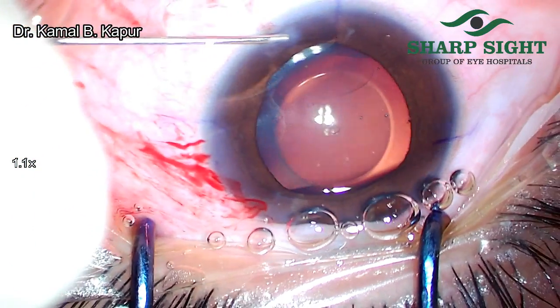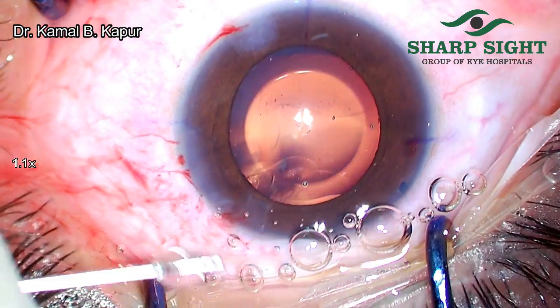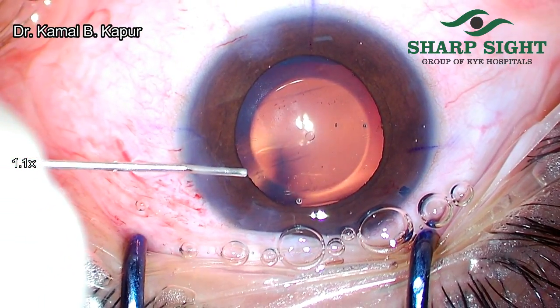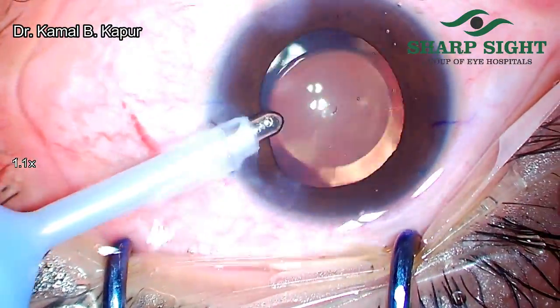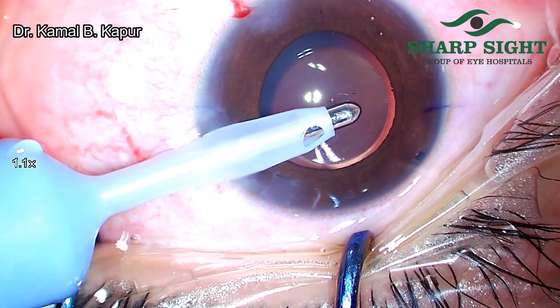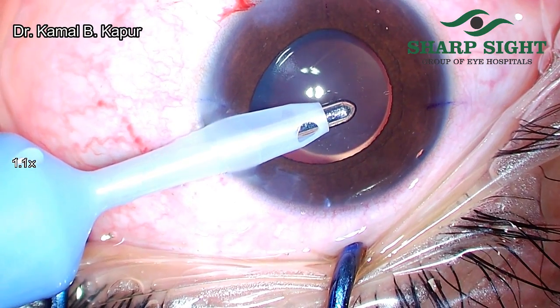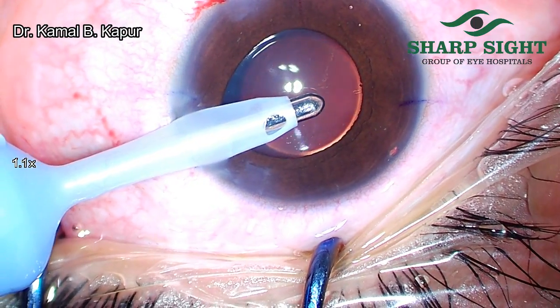Having done that, we slowly hydrate the wounds before we start aspiration of viscoelastic. This is important because once we finish the irrigation-aspiration of viscoelastic and pull out the irrigation cannula, sometimes the anterior chamber may collapse and cause re-rotation or forward movement of the ICL. Thus, we have evolved this technique of hydrating the wound prior to starting the irrigation-aspiration. It is recommended that the central hole of the ICL is where we pull the viscoelastic out.